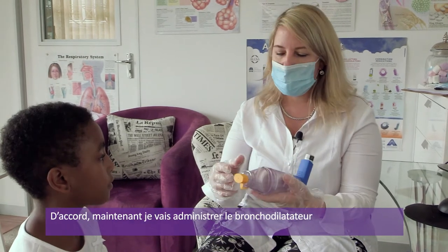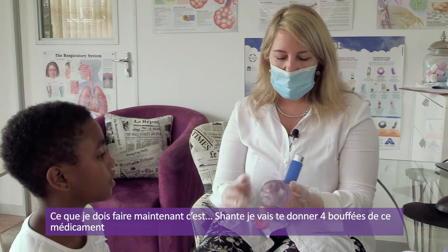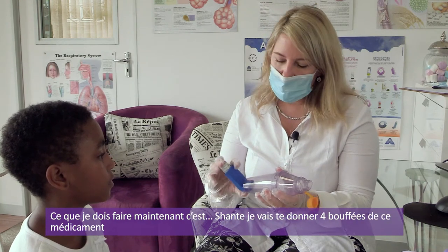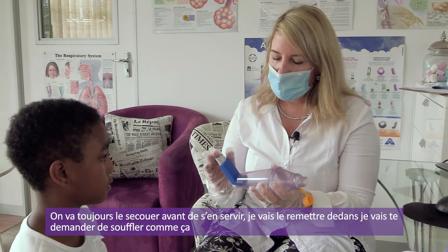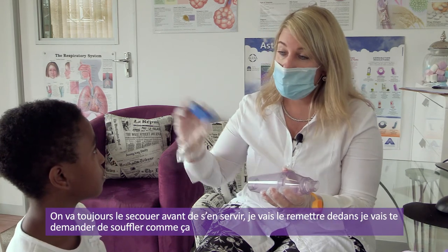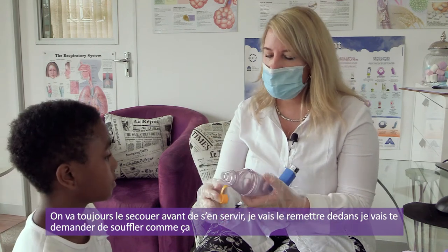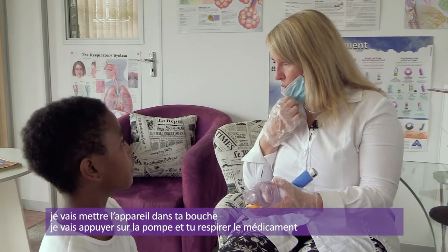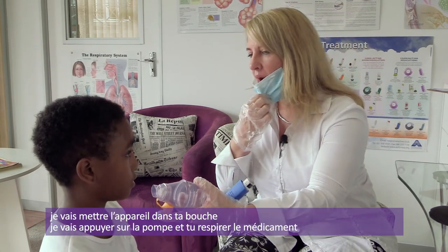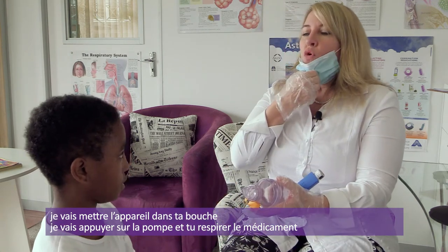Okay, so now I'm going to actually administer the bronchodilator. So what I need to do now is, Shanti, I'm going to give you four puffs of this medication. Okay, what we're going to do is always shake it before we use it. I'm going to put it into here. I'm going to ask you to breathe out. I'm going to put it in your mouth, and I'm going to press it, and you're going to suck it in. Can you do that? Okay.